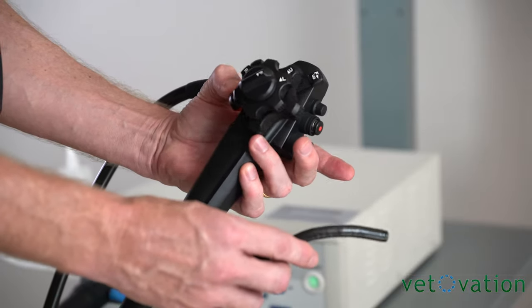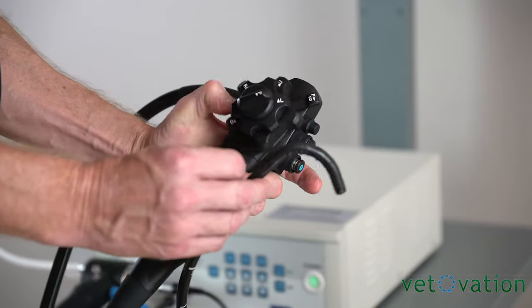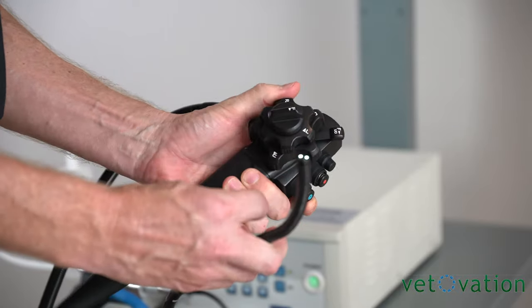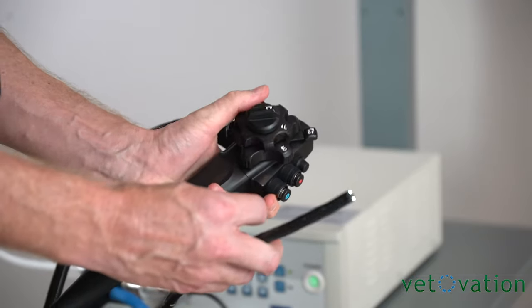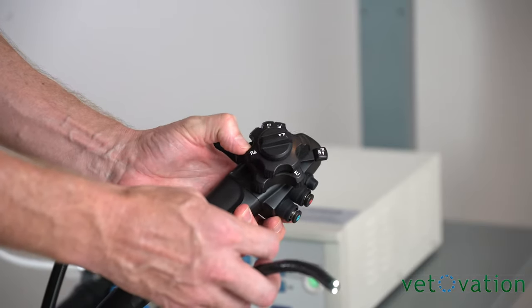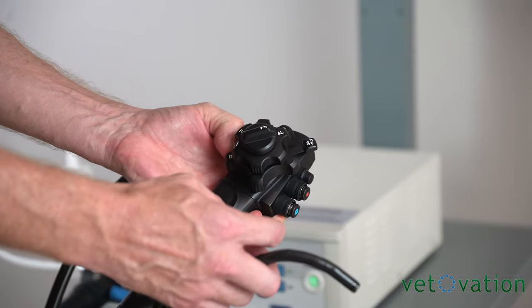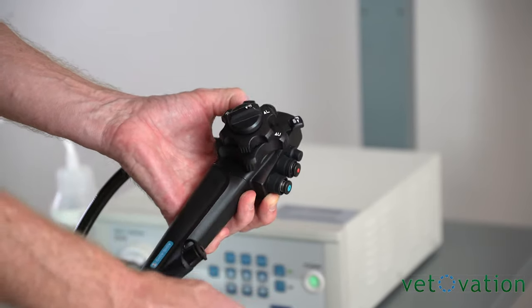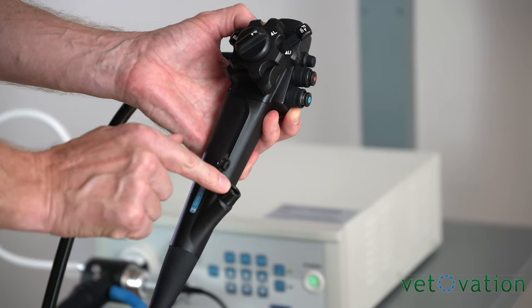The large dial controls retroflexion of your scope back and forth and then the smaller dial turns your scope right and left. The knob at the front will lock your scope in place for the small dial. The knob in the back will lock your scope in place for the back dial. Instruments can be introduced down the working channel.